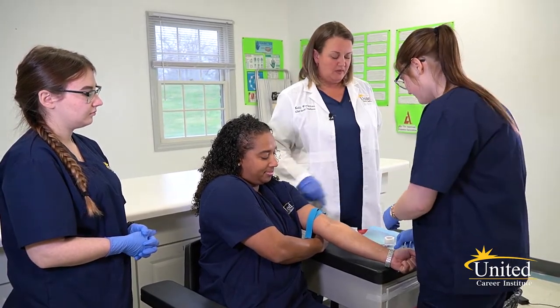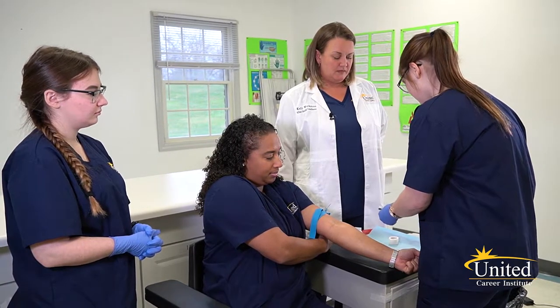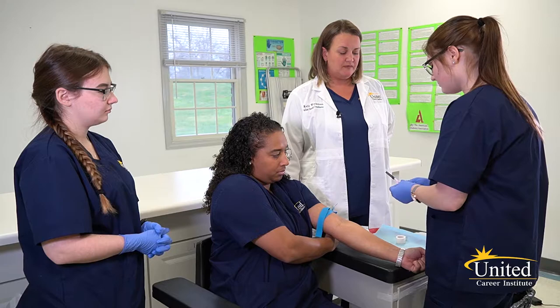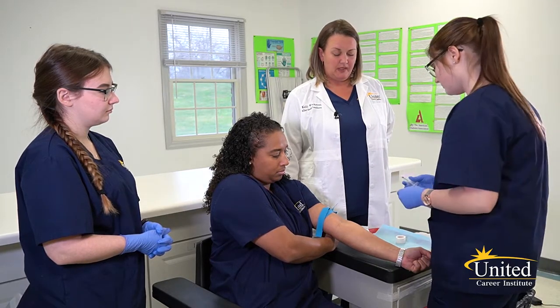Put the holder on the needle. Pull back the safety device and uncap. Anchor the vein.